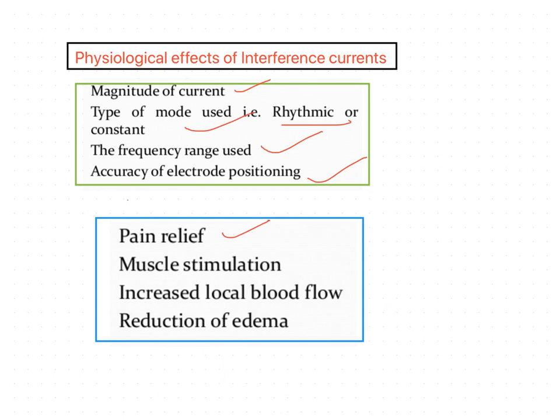And there is an increase in local circulation, which may be produced by either the local pumping effect of the stimulated muscles or the effect on the autonomic nerves, and therefore blood vessels may help remove chemicals from the area which are stimulating nociceptors. Short duration pulses at a frequency of 100 Hz may stimulate large diameter nerve fibers, which will have an effect on the pain gate in the posterior horn and inhibit transmission of small diameter nociceptive traffic.